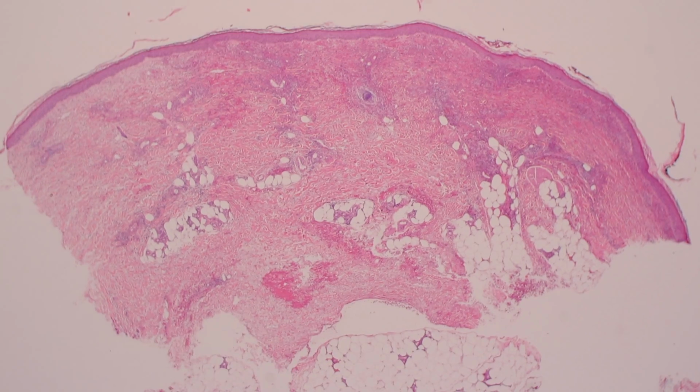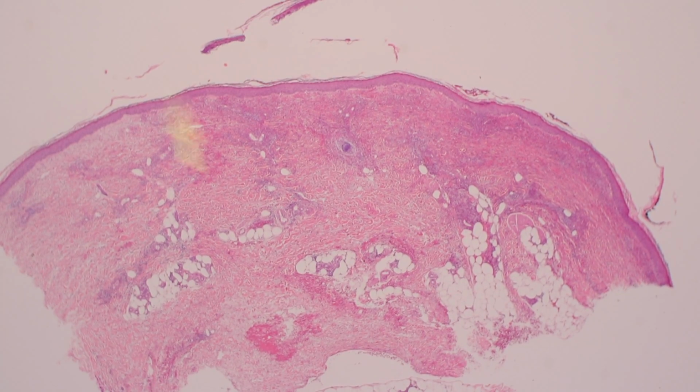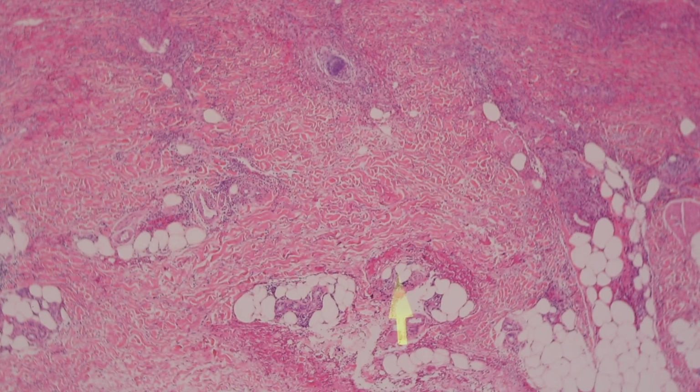So here's one example of such a case. And you can see that definitely there's a lot of infiltrate up here in the superficial dermis, but it also extends down into the deep dermis and even starts getting into the little outcroppings of subcutis that we have here.